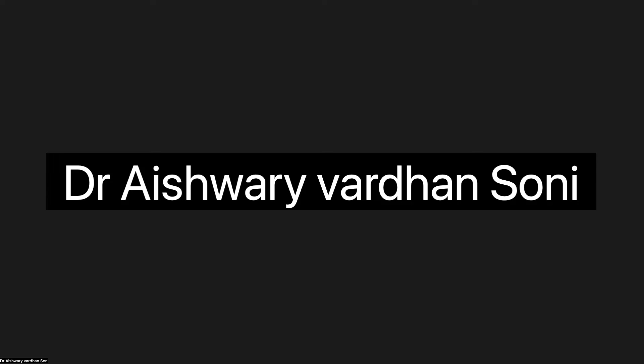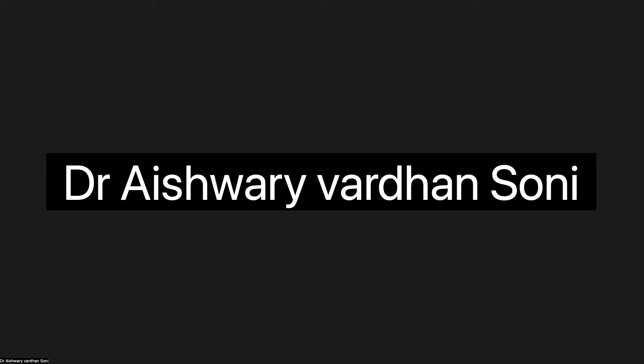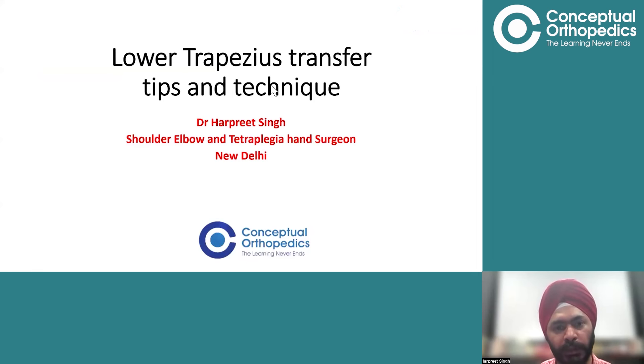Good evening students, I am Dr. Harpreet. Today we will be discussing a technique which has been recently advocated for irreparable rotator cuff tears. I will show you the tips and tricks and technical part — not going much into theory, but showing a few videos on how to do this surgery. Lower trapezius transfer — that is what we are talking about.